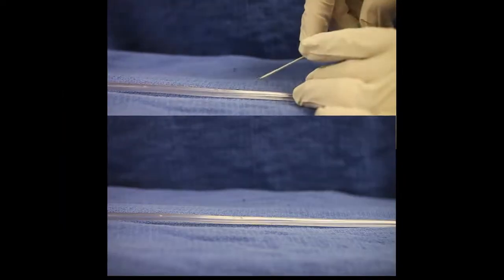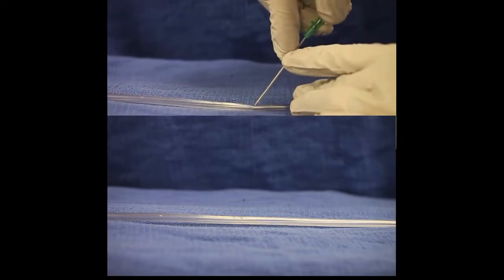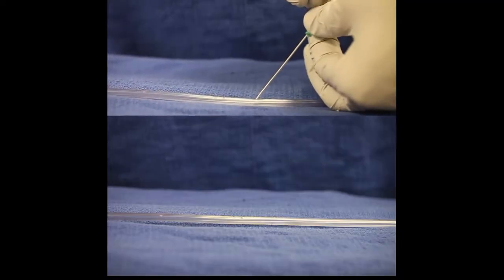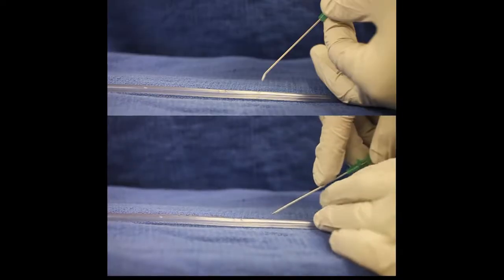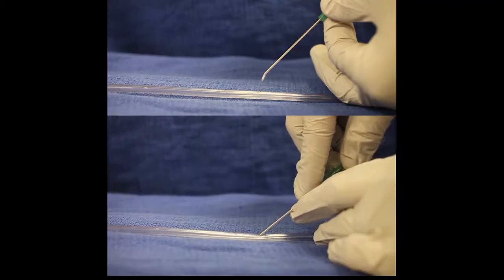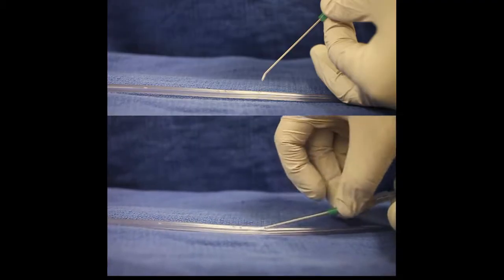Lastly, you're going to want to make sure that you have a good angle before you advance the catheter. Oftentimes these veins are going to be a little bit deeper, so you'll have to go at a sharper angle. If you don't flatten relative to the skin before you advance the catheter, you might not be able to get it in, or worse, you'll go through the vein and blow it. In this example, I'm still at a sharp angle, get in the vein, and before I advance the catheter, I flatten it relative to the patient and then advance it.